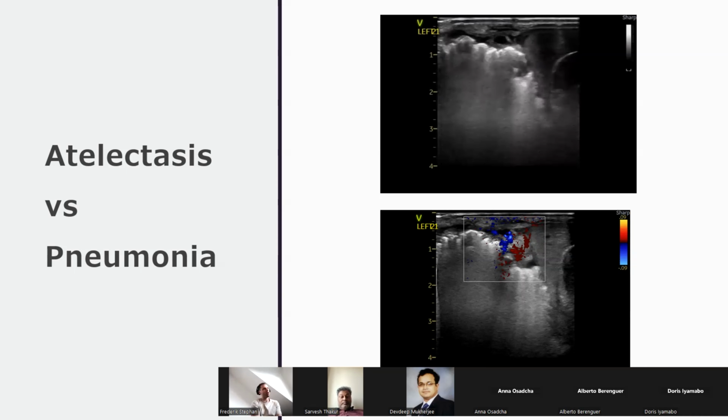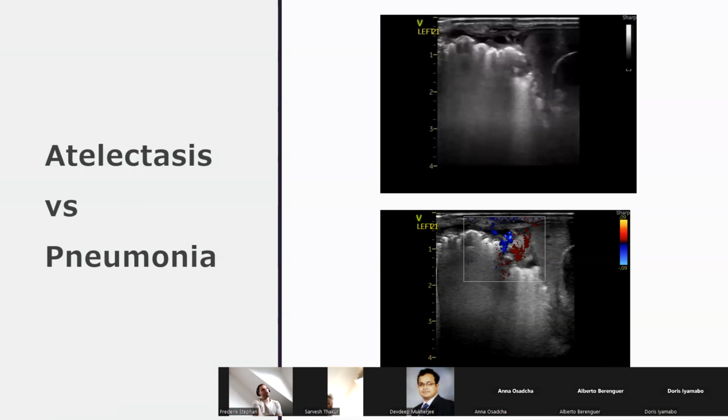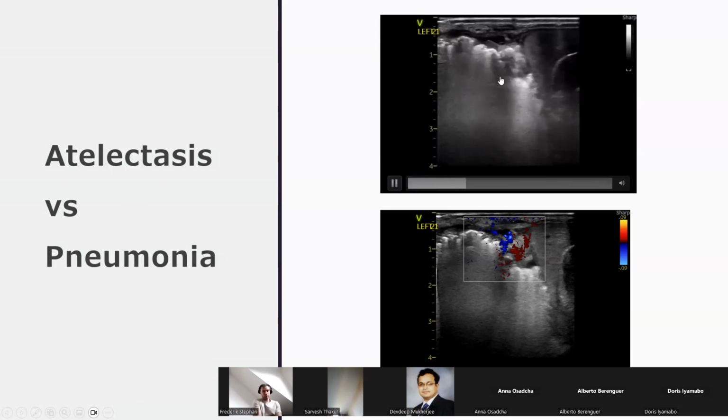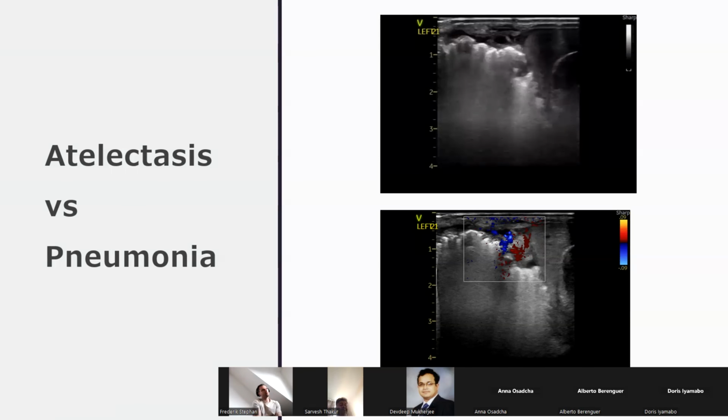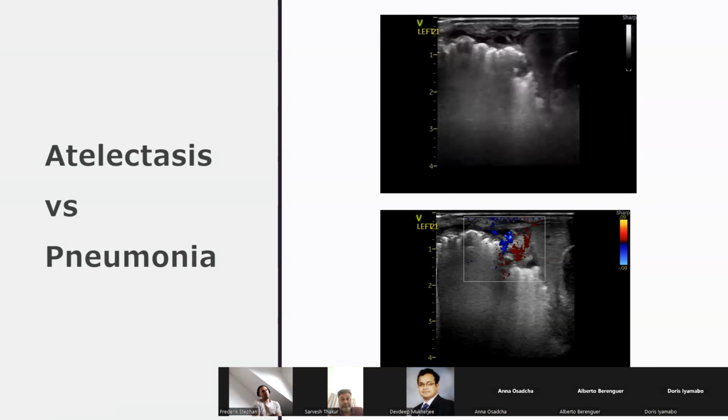This is a very bad one. I can't see the pleura, it's broken, with lots of B-lines and consolidation. Without the history, it's difficult to make thoughts, but it can be atelectasis or consolidation. I'm not sure about bronchograms. I think they are static. Yep. I agree.